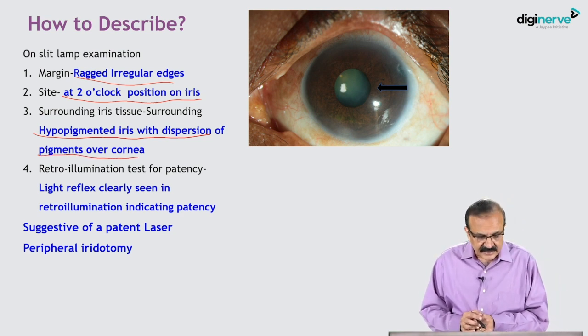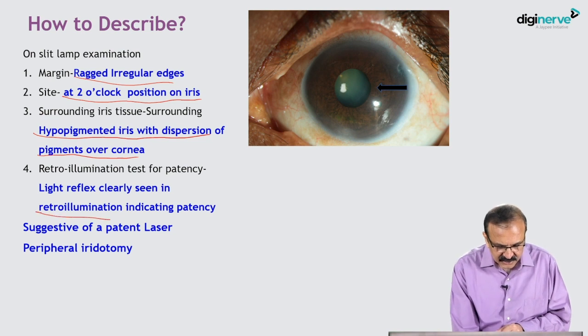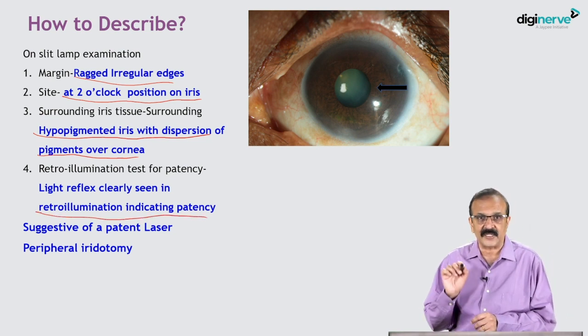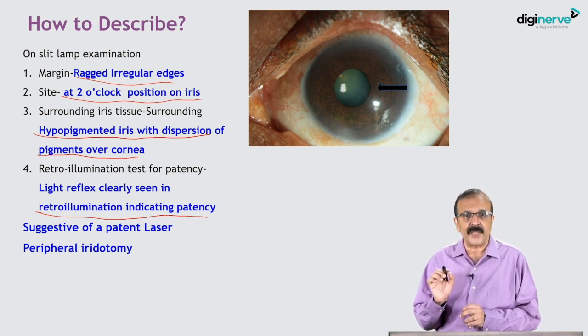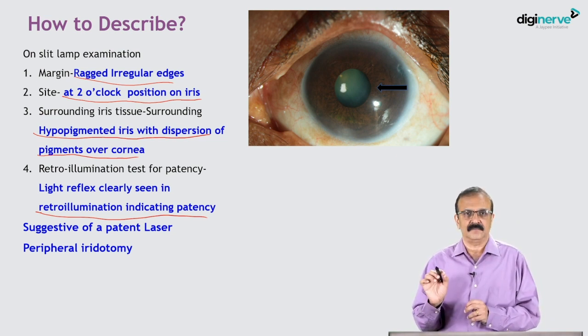Light reflex clearly seen in retroillumination indicating patency of the defect, suggestive of a patent laser peripheral iridotomy.